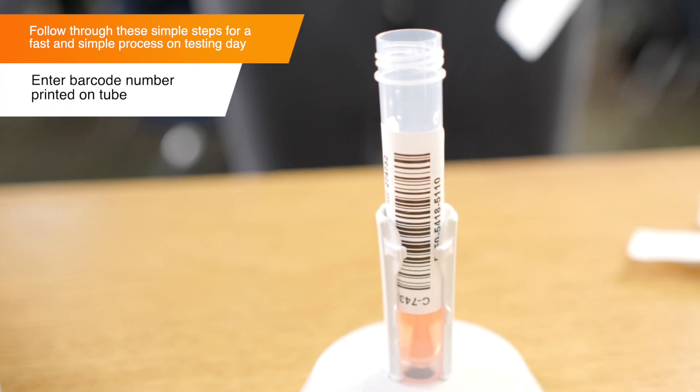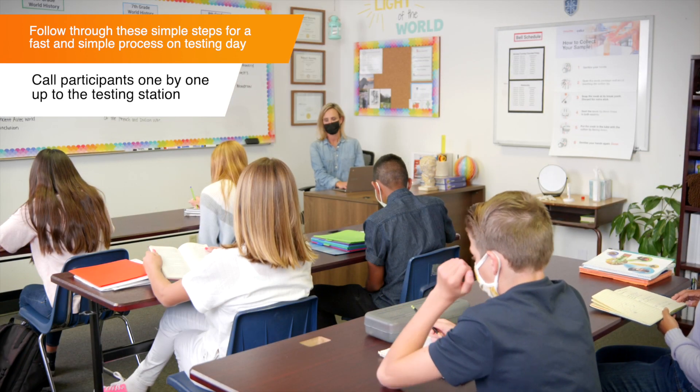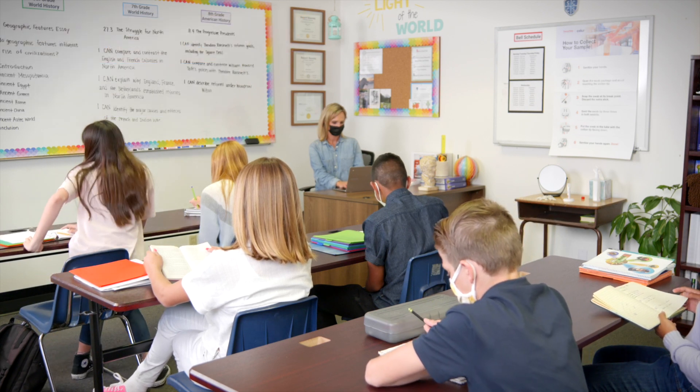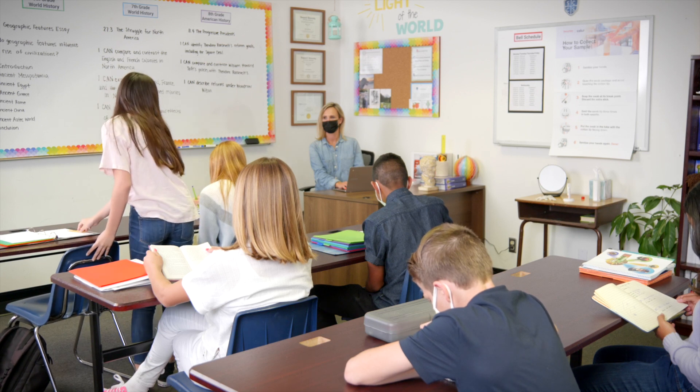Start by entering the barcode number printed on the tube. Next, look up a participant's name and call them up to provide their sample. When students are called up, they should leave their coat, bag, and other loose items at their desk.